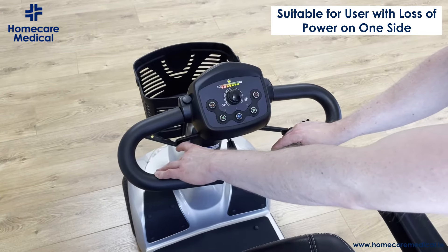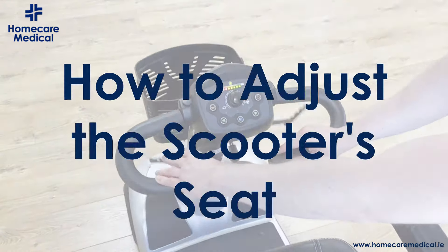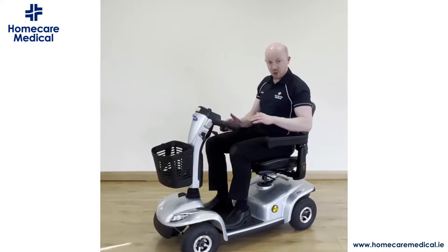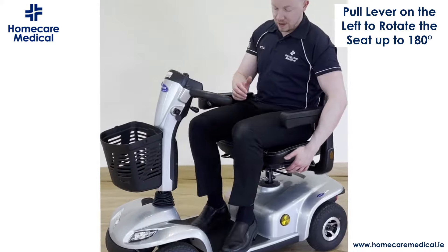The Leo also has a reverse feature on the left hand side that does the exact same thing, but in this case you push it away to accelerate and pull it towards you to reverse.